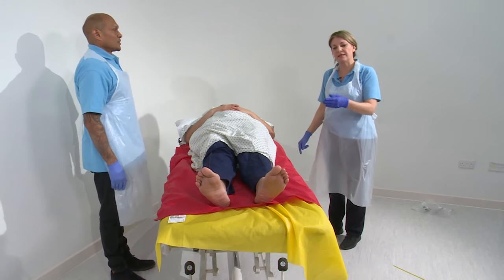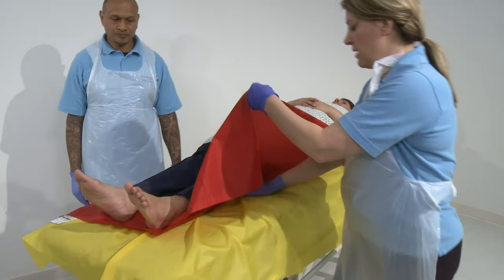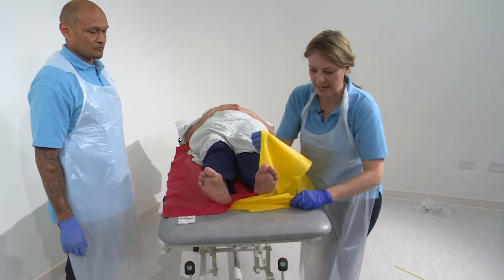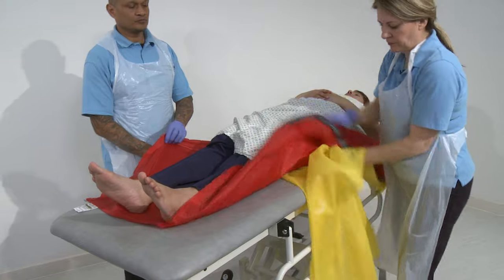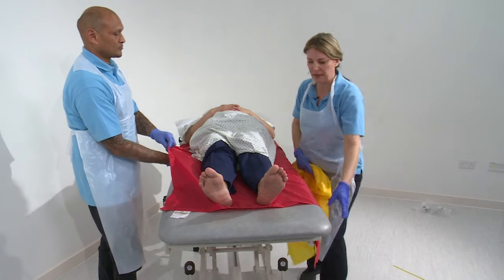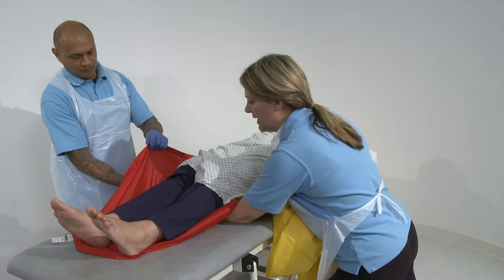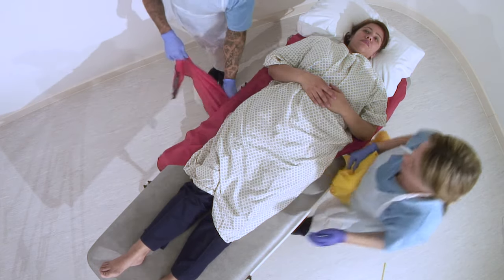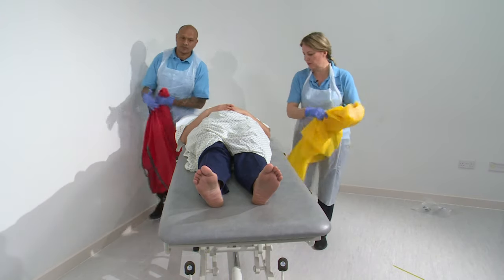Once we've transferred our patient we need to take the slide sheets out, so there are a couple of ways that I can do that. I can come in underneath the back of the leg and pull it through towards me, but actually here I've got plenty of slide sheet, so all I'm going to do is reach across and take the bottom slide sheet out first and bring that through. All I need to do is pull down and away and my slide sheet will come out without my patient moving. For my colleague I take hold of this side, put it back underneath itself and underneath the back of the knee. He's now got that and he can pull the slide sheet down and away gently and it will come out. And again, if we do it smoothly, our patient shouldn't move.